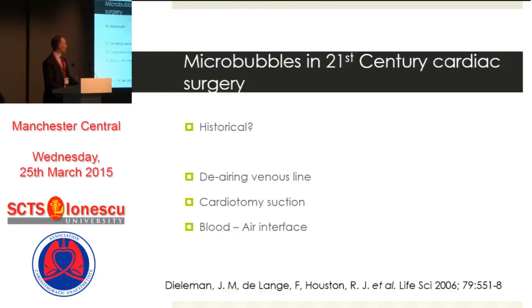cardiac cases. But we would be wrong to consider air entrained into the circulation as a merely historical event. There are numerous interventions by perfusionists, surgeons, and even ourselves as anaesthetists that risk and indeed do introduce air or other gases into the circulation. Three notable examples are our often failure to completely de-air the venous line. We continue to use cardiotomy suction, and in the vast majority of bypass with a reservoir, we have a continuing blood-air interface.